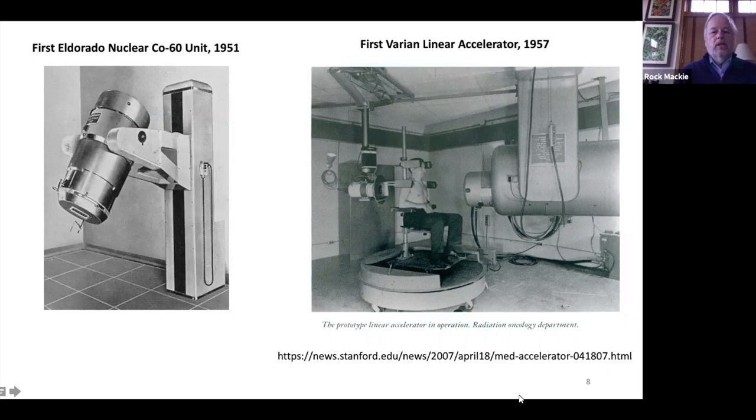So what happened? In the 50s, we still had a lot of patients who were diagnosed at stage four. They were bedridden. They weren't ambulatory. And so it was felt that if you could have a C-arm gantry to rotate about the patient, you could treat all the patients the same way, lying down. And then, of course, as we got imaging systems like CT scanners, they were also developed for patients being on a couch. When CT really entered radiotherapy, it pretty much killed upright radiation therapy.